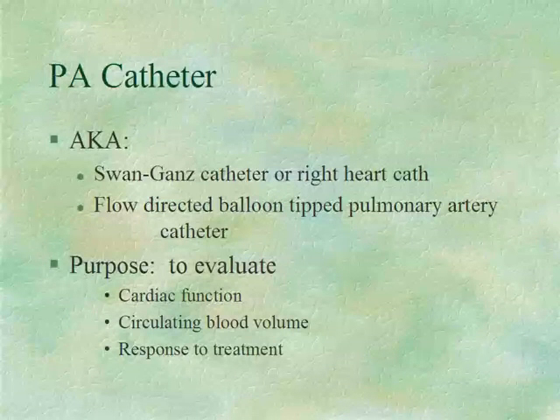Unfortunately, it has not been shown by research to have any major benefit in decreasing mortality or morbidity. And so what we used to use an awful lot before 1992 has decreased since '93 by about 63%. So we still do a Swan, but not as often as we used to do.